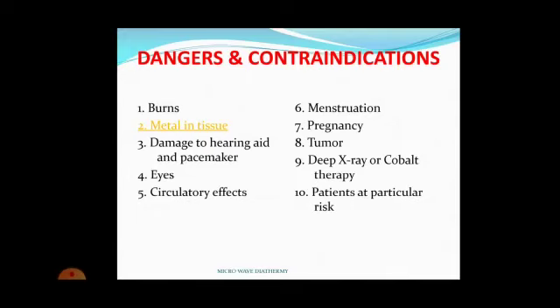So before we give microwave diathermy we should take the history and always ask whether you have any internal fixation in your body. If it is there we can give, but with precaution. In case of shortwave diathermy, the damage will definitely be more because it is based on an electric field. Here we can give but with precaution, so it is a relative contraindication.